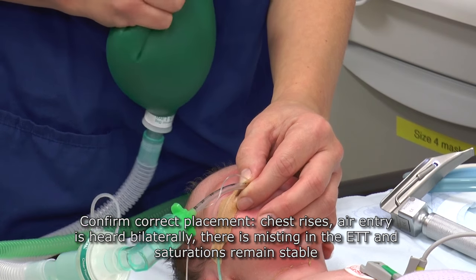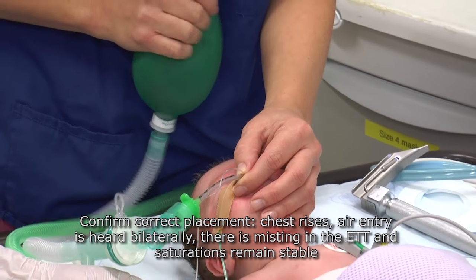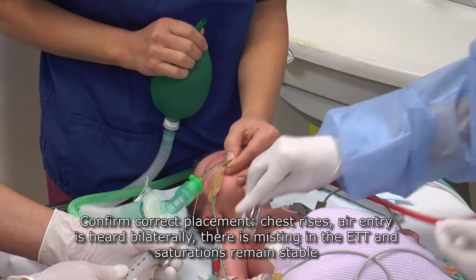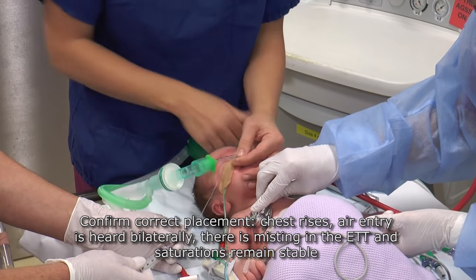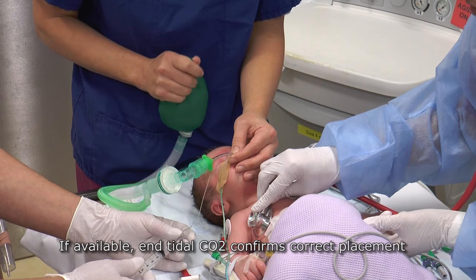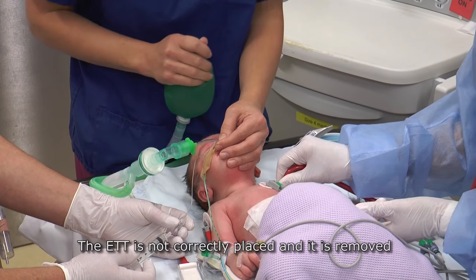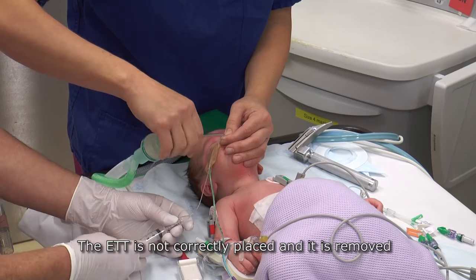Confirm correct placement: chest rises, air entry is heard bilaterally, there is misting in the endotracheal tube, and saturations remain stable. If available, end-tidal carbon dioxide confirms correct placement. If the endotracheal tube is not correctly placed, it is removed.